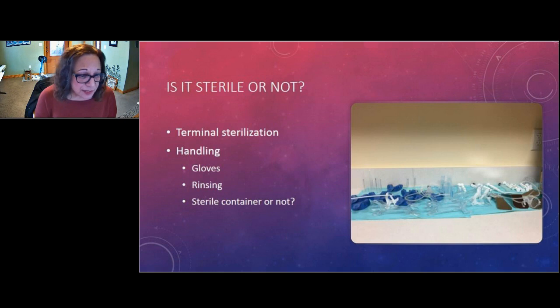The cold chemical sterilants have been approved for that process because they have a better kill, according to the microbiological testing, than the chemicals that have not been approved for cold chemical sterilization. The principles are the same, however. Okay. Next question. Yes, next question.